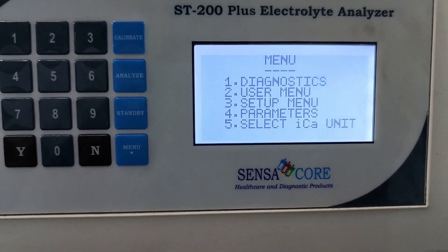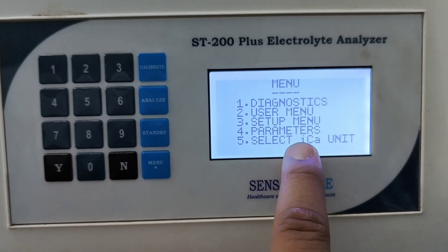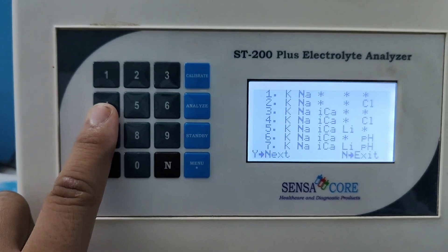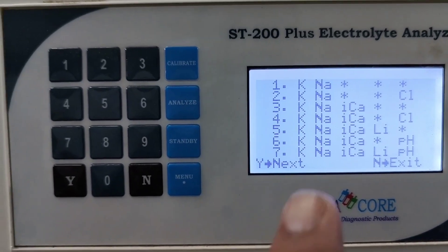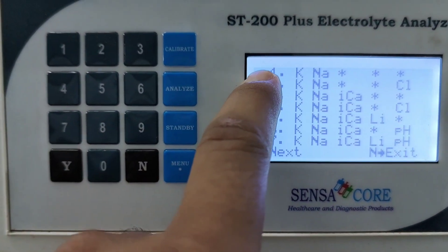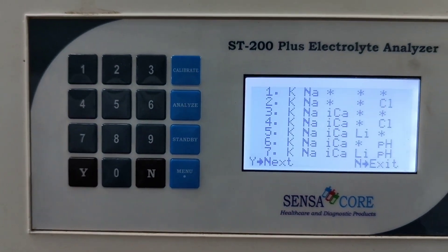I can set parameter 2. This is the number 4 parameters. You can select the parameter from here. Number 1 — sodium potassium. If you want to run sodium potassium only, you can select number 1 by pressing 1 and the machine gets ready.